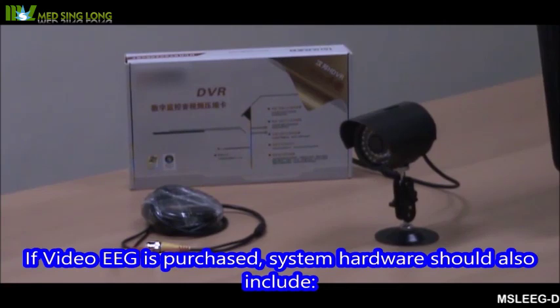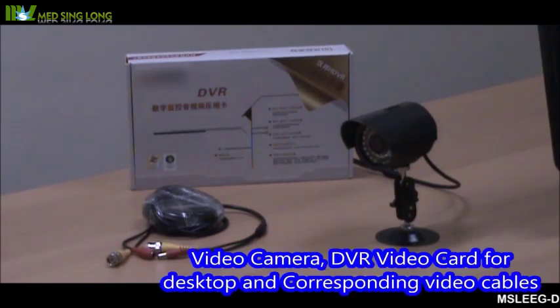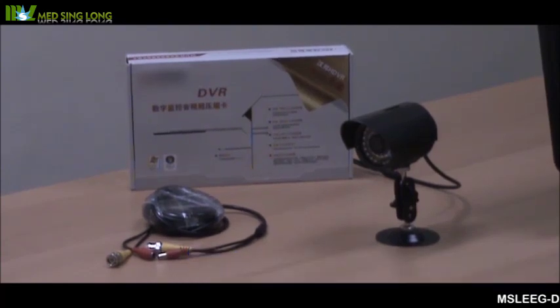4. If video EEG is purchased, system hardware should also include: video camera, DVR video card for desktop, and corresponding video cables.